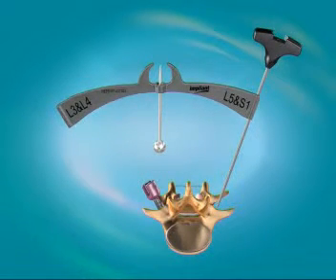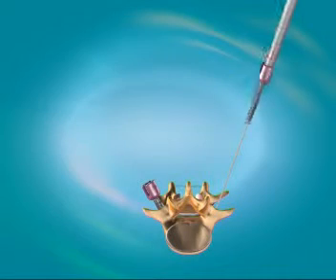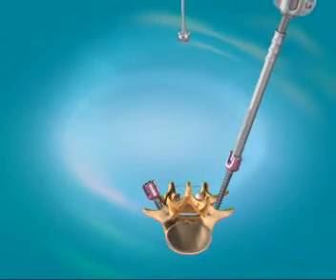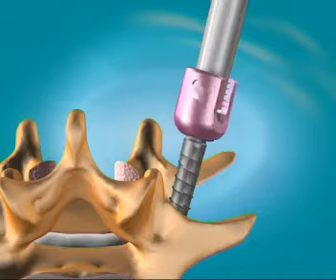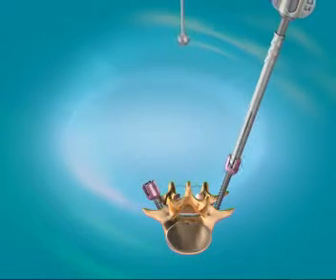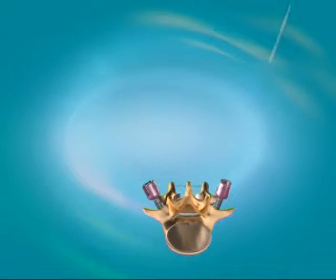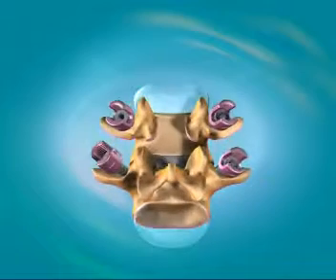Another critical step is to choose the appropriate size pedicle screw. Optimal placement of the TOPS system requires that the pedicle screws be approximately 5 millimeters longer than what you would select if you were performing a fusion procedure. Also, the largest diameter screw that can be accepted by the anatomy of the pedicle should be used to maximize the pull-out strength of the screw.